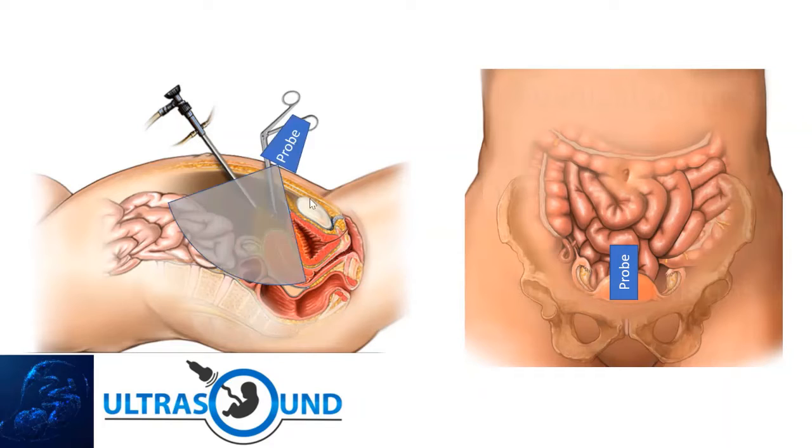If you can see, when we are lying down, the abdomen curves something like this. So your probe will automatically be pointing towards the head of the patient. So you cannot really see well the vagina, the cervix and all to guide you, and even the bladder you cannot see properly.